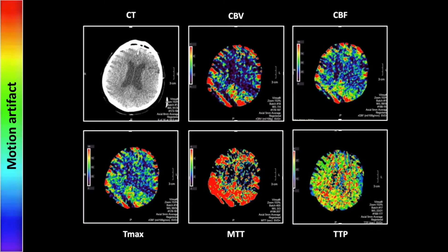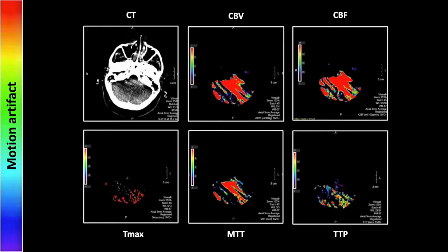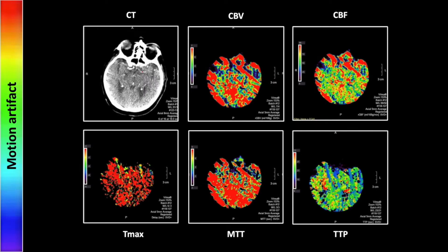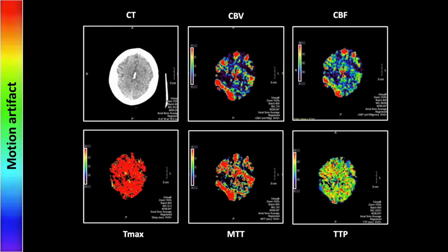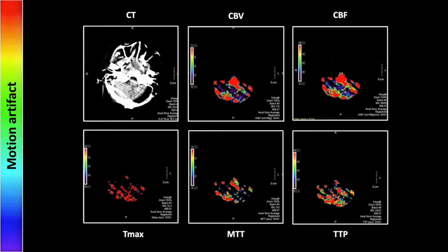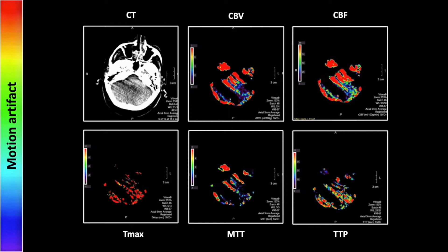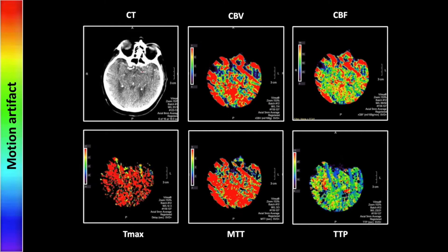We'll start with a couple of straightforward artifacts. This is a case with motion artifact — it looks pretty much like motion artifact on any CT scan. You can see these streaks across the entirety of the image, and in such a way that all images in all of these series are involved. Obviously this will pose some challenges when it comes to interpretation. So that is motion artifact.